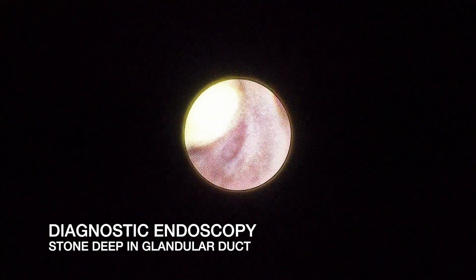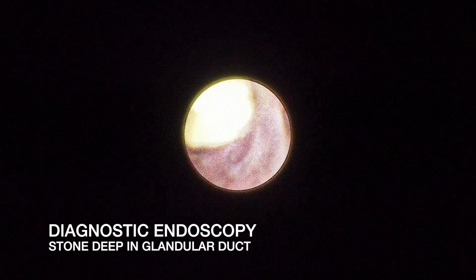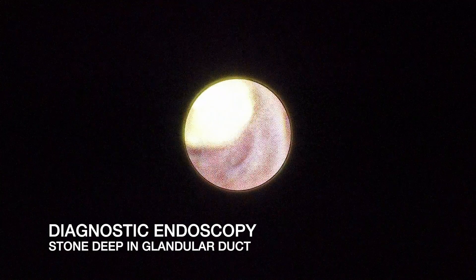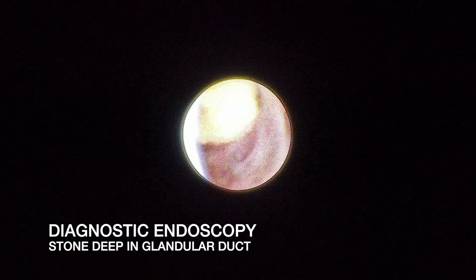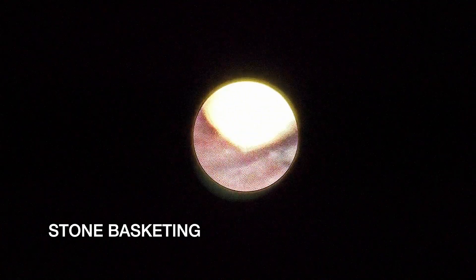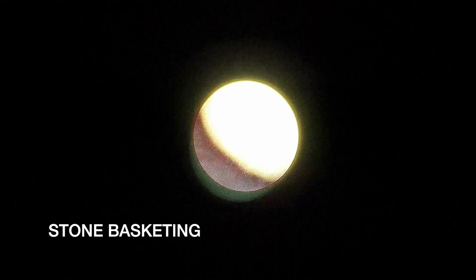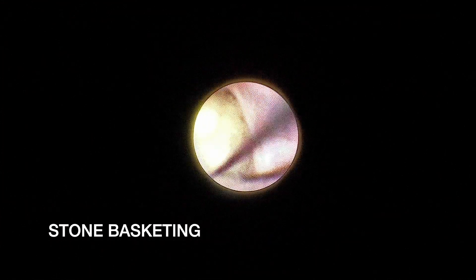This was at the level of the tertiary and quaternary branches of the duct. Owing to the narrow diameter of the duct, we knew that simple extraction was going to be difficult. However, we did try to basket the stone and attempt to extract it completely in one piece.